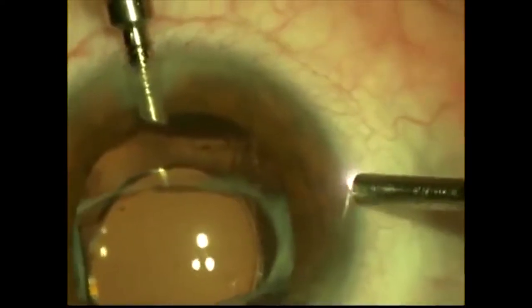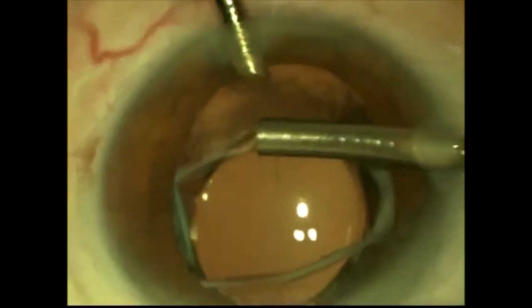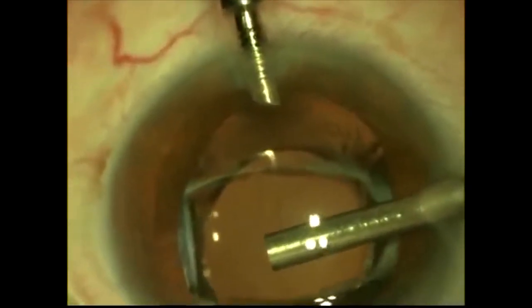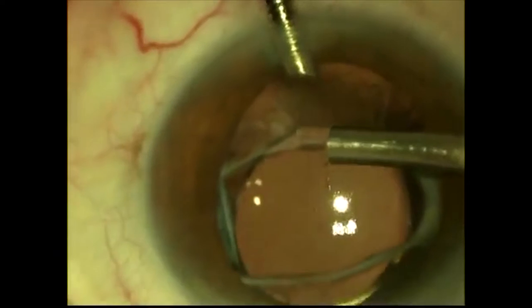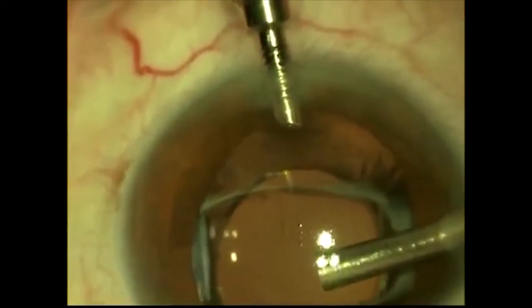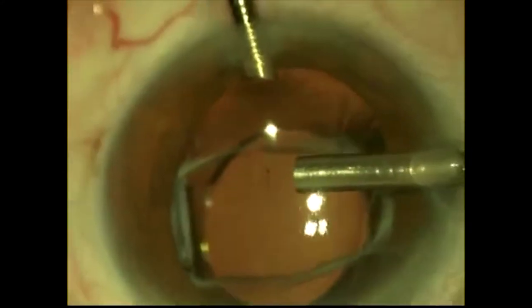In this initial foray, I'm getting the eye set up to look around. This is the endocular cyclophotocoagulator, but I just used the endooptics to take a careful look underneath the iris to see what's going on. You might see over here on the left that it looks as though part of the haptic may be hung up on the capsule. And lo and behold, when we look with our endoscope, there it is.